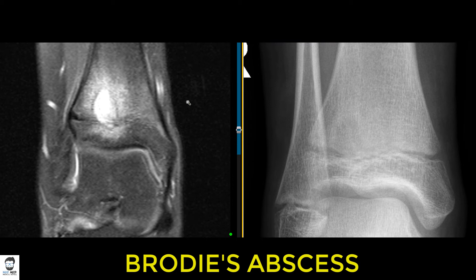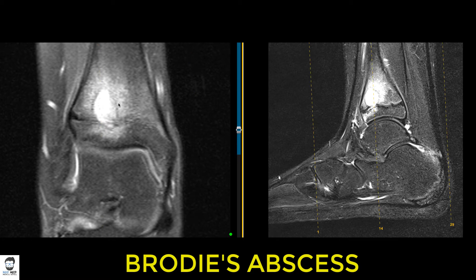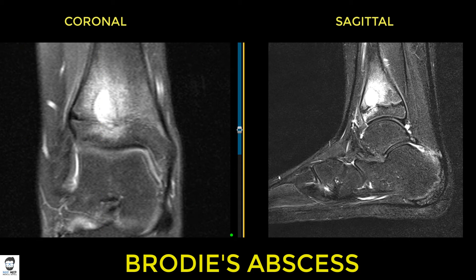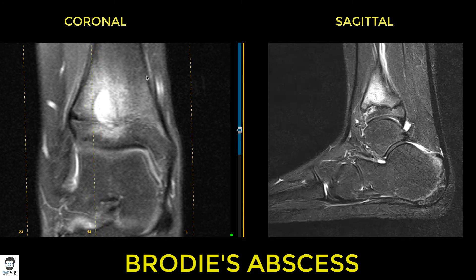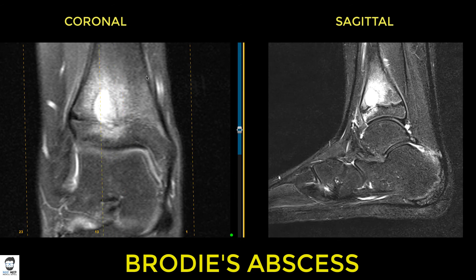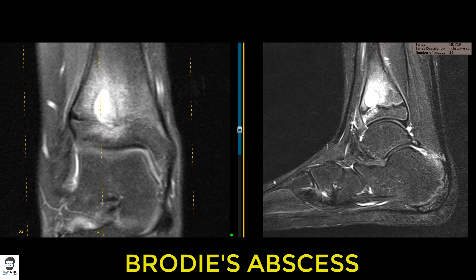Looking at both coronal and sagittal images simultaneously, you can see the lesion in the distal tibia on both views. Scrolling through both, the two images change corresponding to each other. You can see a reference line in the center of the lesion on the coronal with the corresponding sagittal view alongside. Always look at all views — now we'll examine the T1 images.